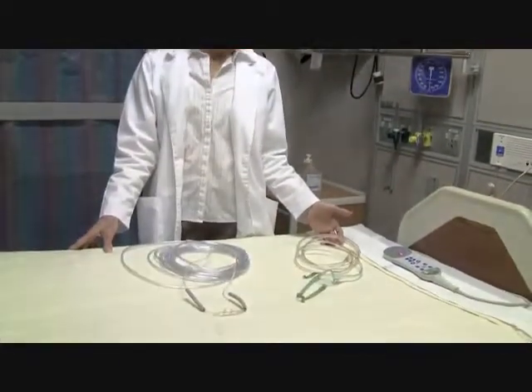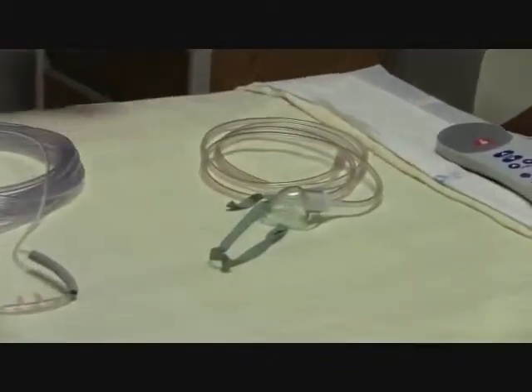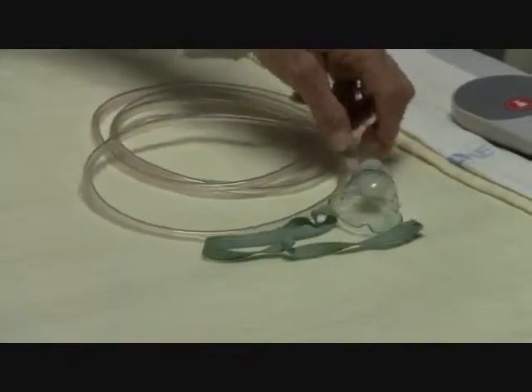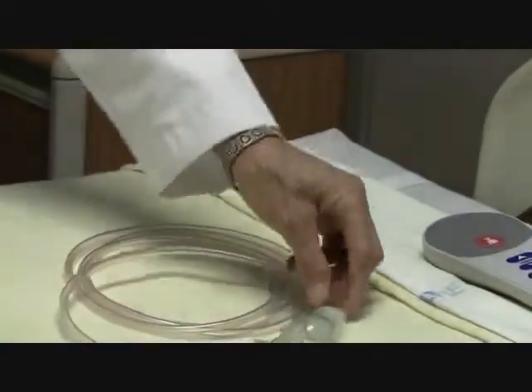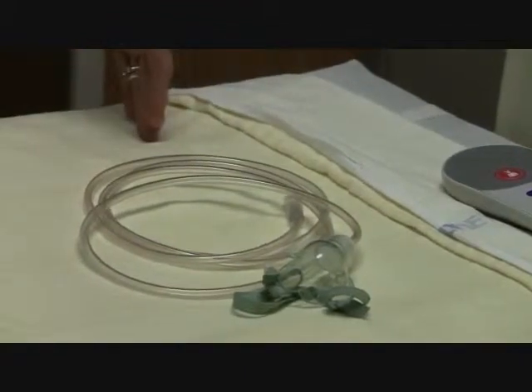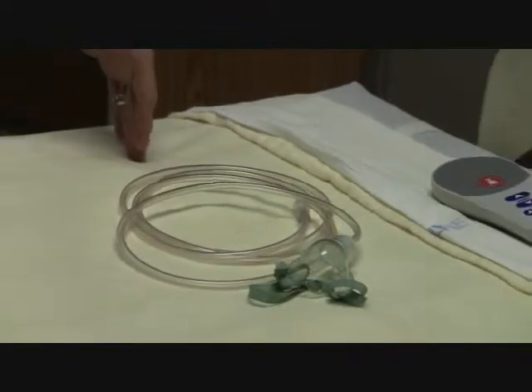Another low-flow delivery oxygen device is the simple mask. It provides FiO2 of 40 to 50%. Now you have to run the simple mask at least 5 liters to flush the patient's own CO2 out of the mask. This happens to be a pediatric simple mask. However, the adult simple mask would be the same, just made for an adult. Like I said, you run it at least 5 liters. You may increase the flow rate to 12 liters depending on the patient's need for oxygen.